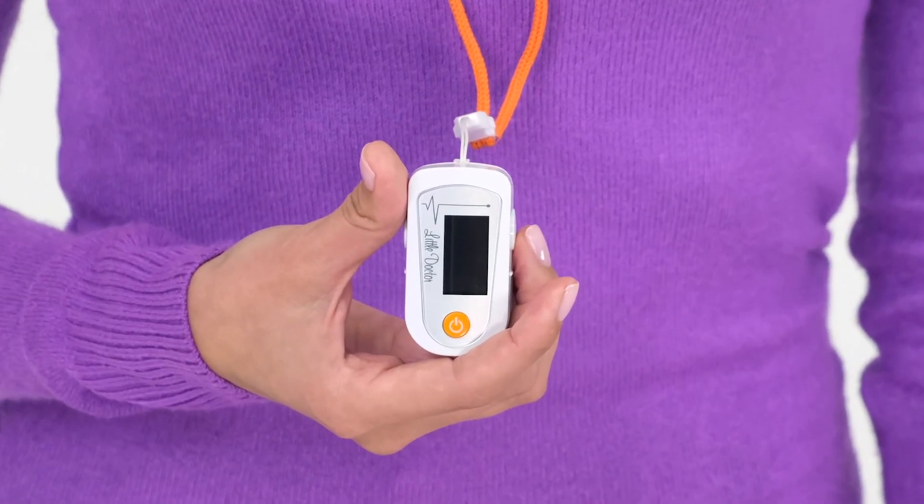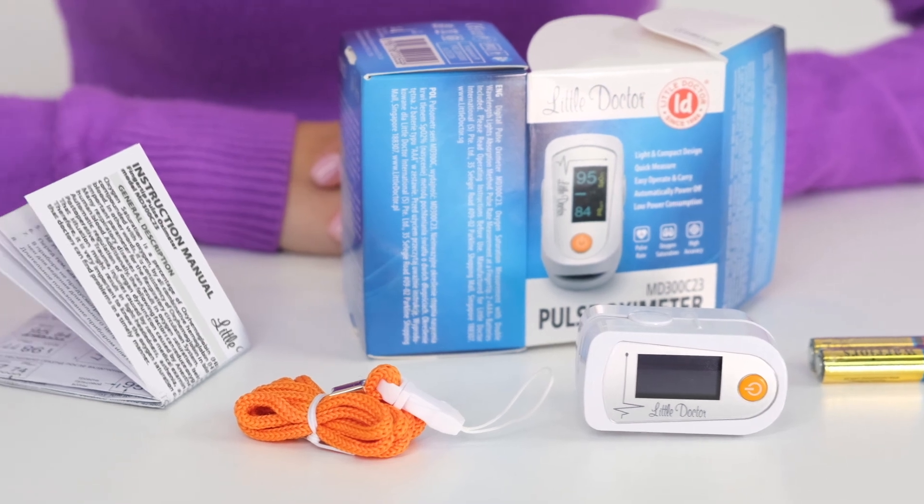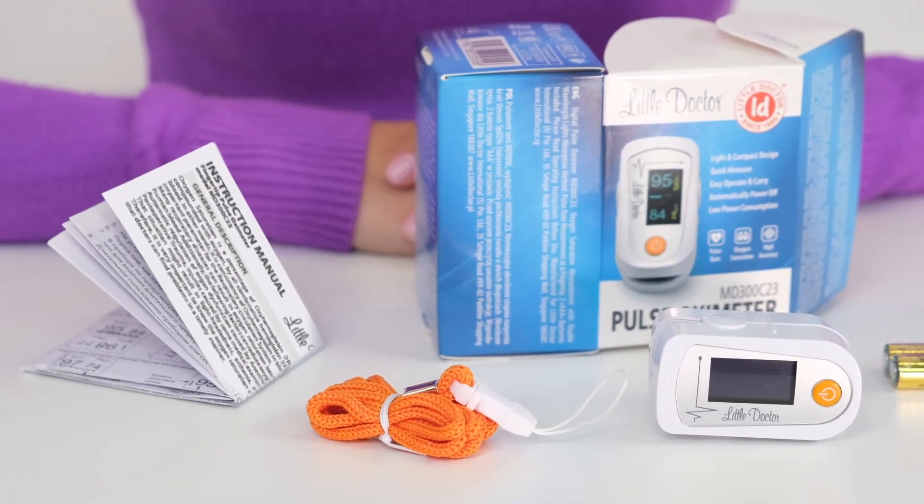The Pulse Oximeter Little Doctor complies with European medical standards. The complete set includes the electronic unit, batteries, lanyard for wearing, and a detailed instruction.